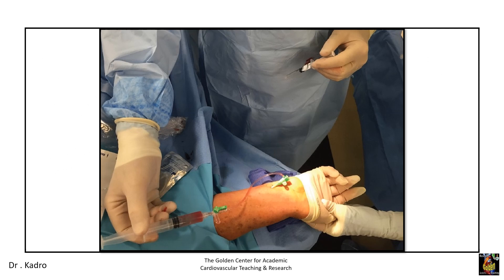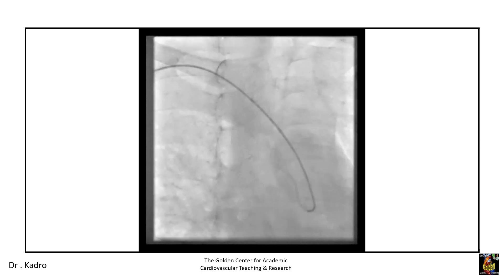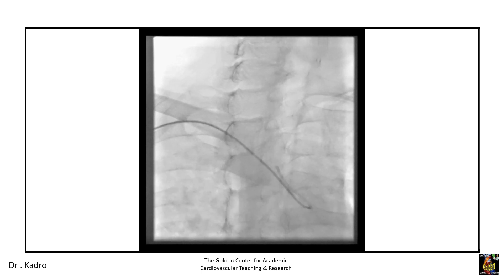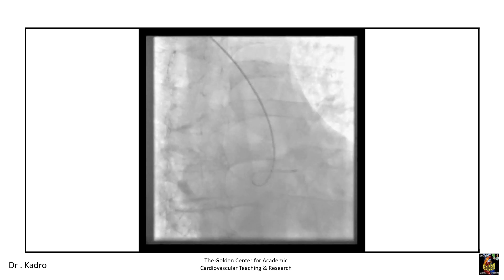Access was obtained, and using a SIM-1 catheter, the catheter was advanced to the ascending aorta and was shaped at the aortic valve. The catheter was then pulled back to the brachiocephalic trunk and slowly pulled back with the tip pointing upward, enabling it to engage the right internal carotid artery.